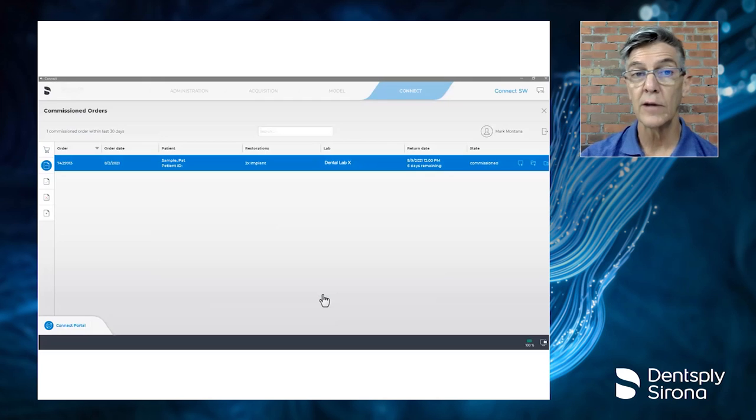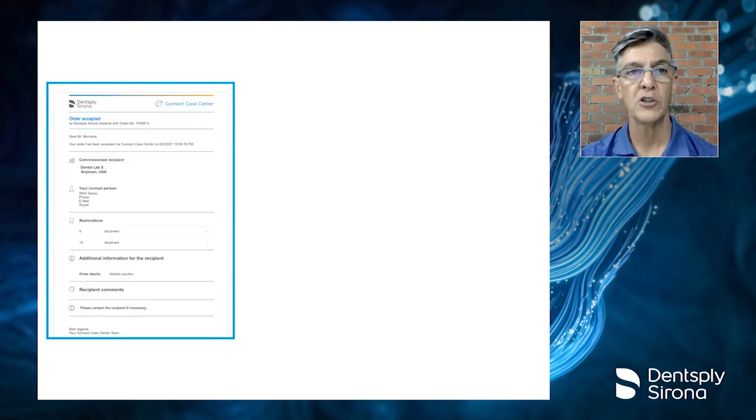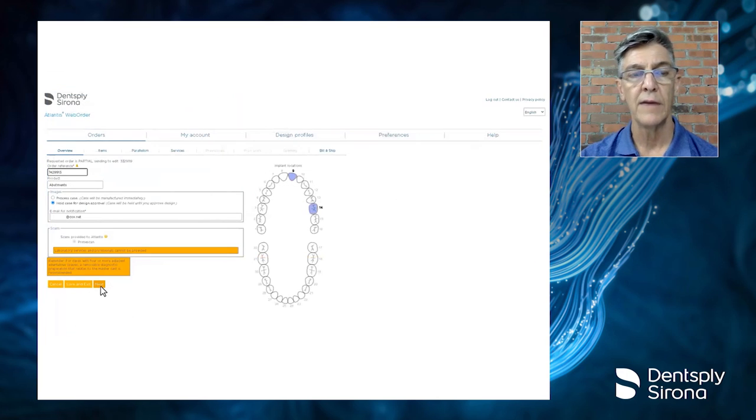Now, the next thing that's going to happen is you are going to receive an email saying that the information has been sent to the laboratory. The laboratory will then receive an order saying to go ahead and place the order for the abutments. So on the laboratory level, they will now be able to order the abutments. In this case, we have our two implants, and they are asking to hold the case because they're going to want to design.